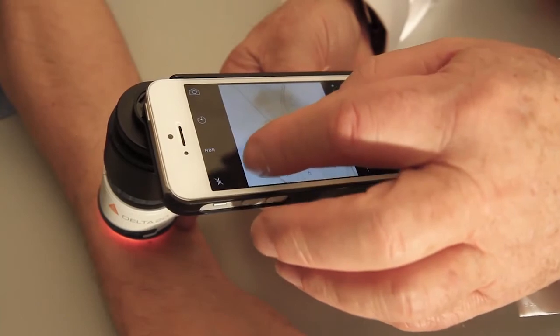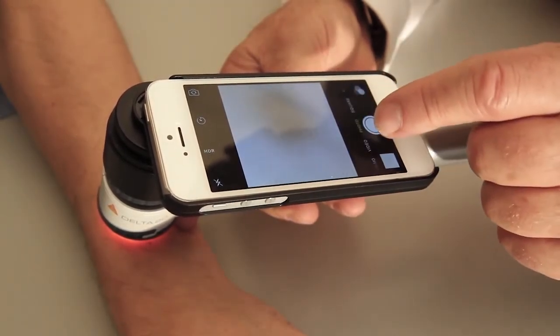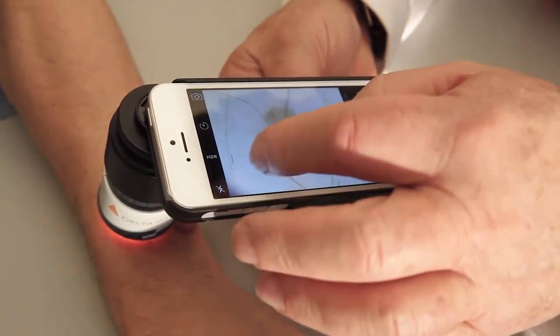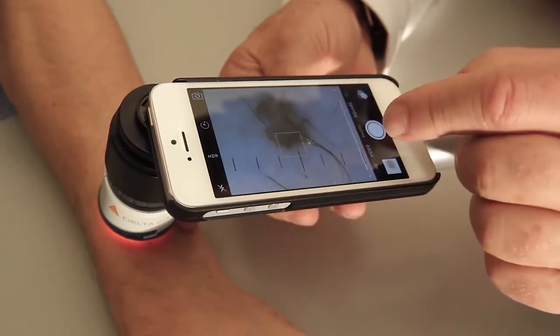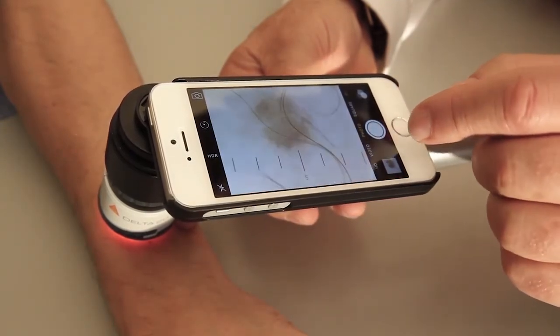That's looking good. Now I want to get it nicely focused. So let's get it properly centered. Still got the graticules just at the bottom. Graticules straight along one line, preferably just off the lesion. The image is now ready to be used.